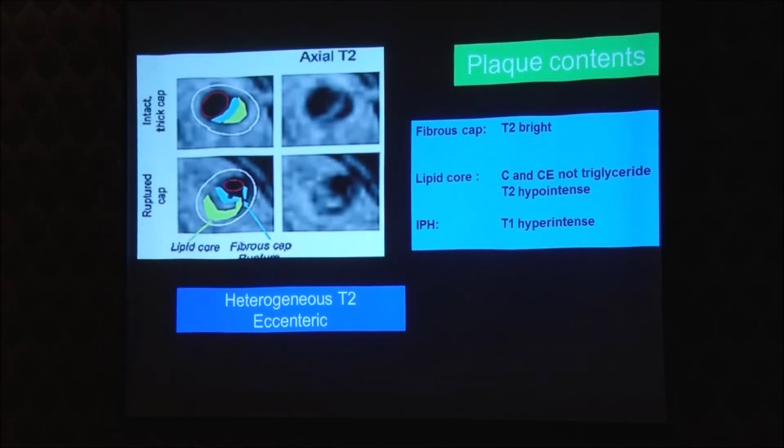So now coming on to the vessel wall imaging itself, I wanted to give a brief about negative and positively remodeled plaques. And one of the take-home points I would say today is, whatever might be the stenosis, first try to rule out atherosclerosis. Atherosclerosis is still common in the 20s and 30s. So rule out atherosclerosis before you can say it is vasculitis.